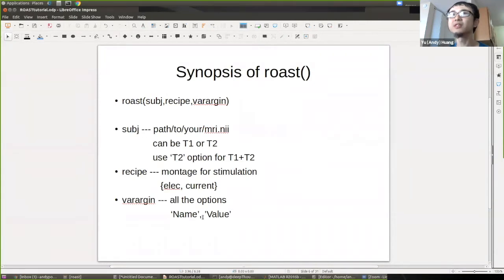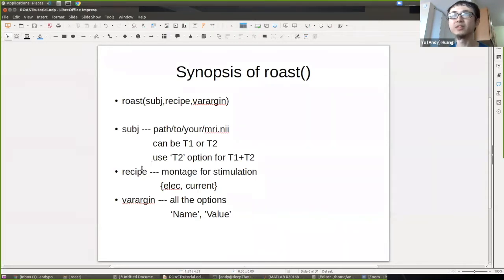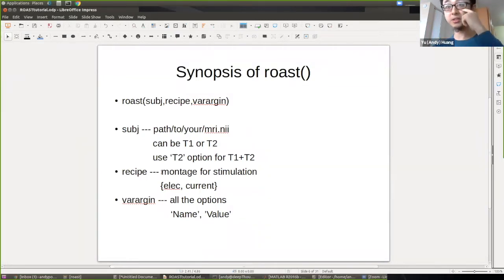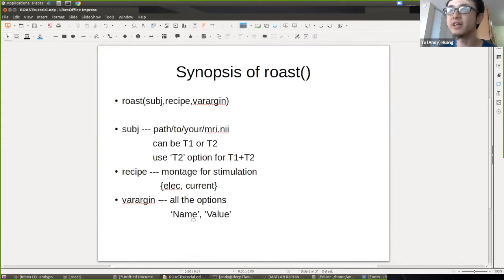Let's take a look at ROAST. The basic synopsis takes two required arguments: first, the MRI of your subject — just the path to your MRI file, which can be either T1 or T2. If you want to use both T1 and T2, use the T2 option. The second argument is the recipe — basically the montage you want to use for your transcranial stimulation — following the format of electrode name and current value. The third argument is optional, using MATLAB name-value pair convention.